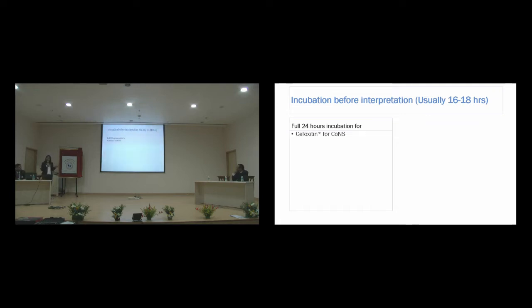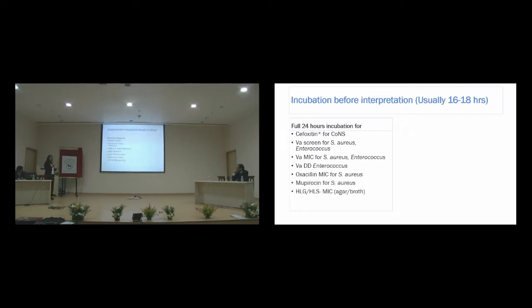When taking the reading of cefoxitin disc diffusion for coagulase negative staphylococci, the incubation has to be a full 24 hours. Also vancomycin screen for Staph aureus and enterococcus, vancomycin MIC for Staph aureus and enterococcus, vancomycin disc diffusion for enterococcus, oxacillin MIC for Staph aureus, mupirocin for Staph aureus, and high-level gentamicin or streptomycin MIC, whether agar or broth dilution, need a full 24 hours of incubation. In a cystic fibrosis patient, when Pseudomonas aeruginosa has grown, the AST plate again has to be incubated for a full 24 hours.